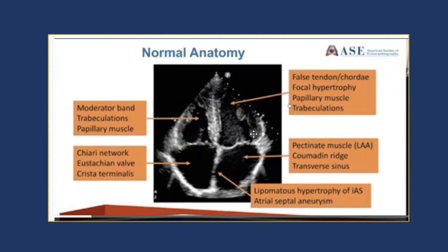In the left atrium, you can have very thickened pectinate muscles in the left atrial appendage, which if you're clearing somebody for a TEE cardioversion or pre-ablation can look like a thrombus. It's good to get different angles of the LAA to make sure what you're looking at is definitely the pectinate muscle and not a thrombus hiding out in the left atrial appendage.